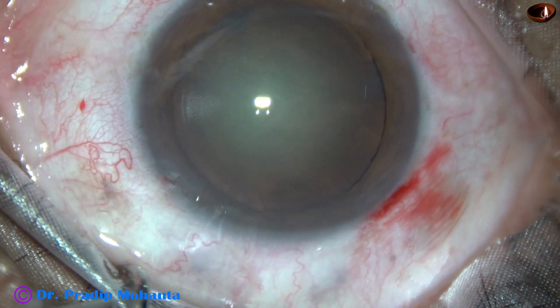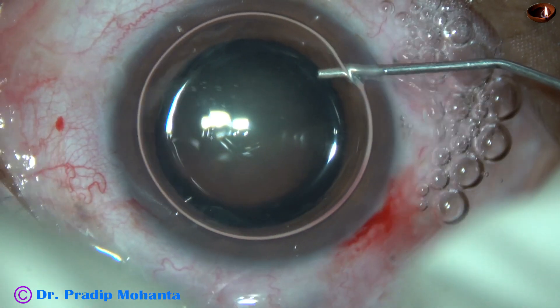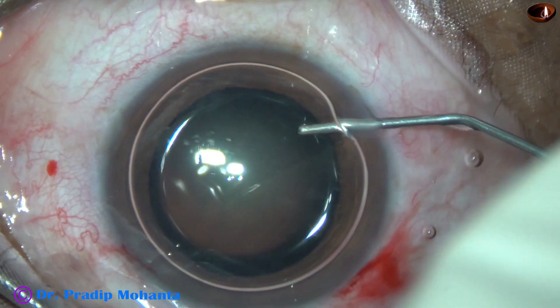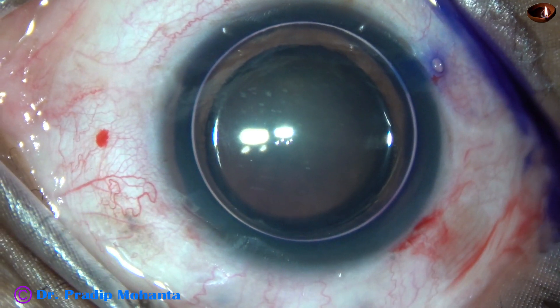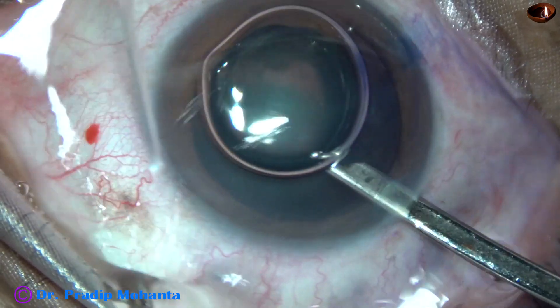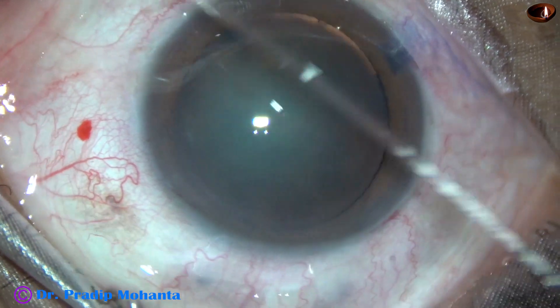Now, to demonstrate the capsulorhexis nicely, I am using Trypan Blue dye to stain the anterior capsule. The dye is applied underneath an air bubble, in such a way that there is uniform staining of the anterior capsule. And now the dye is washed out with balanced salt solution.